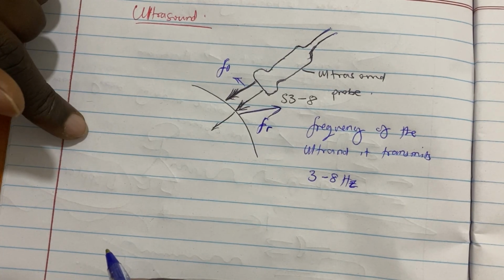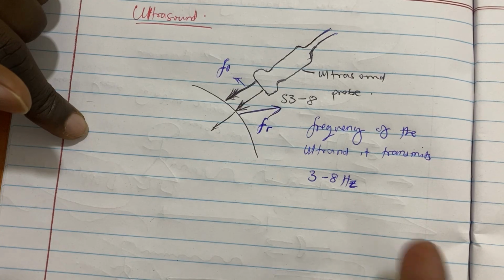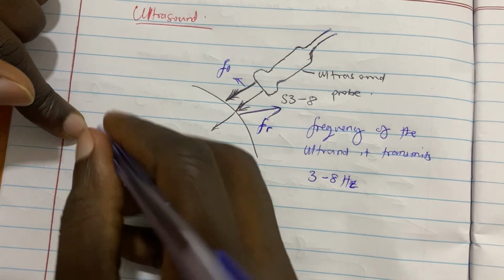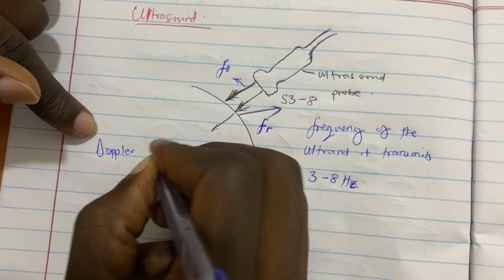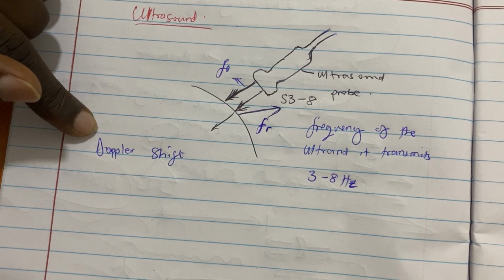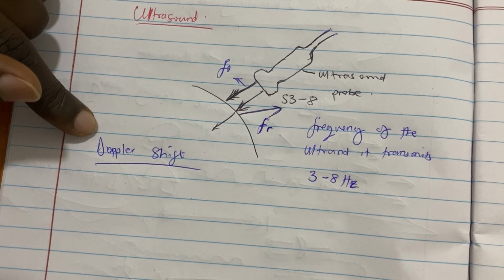Now when we talk of Doppler, I told you it is the Doppler effect or Doppler shift. That's how we are going to apply it here in echo.